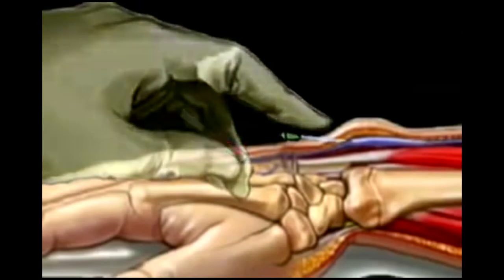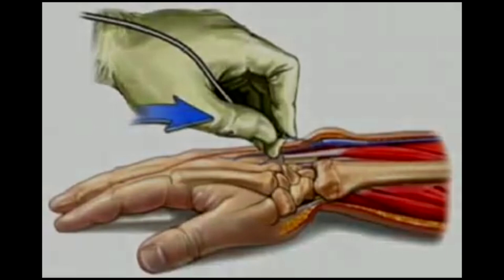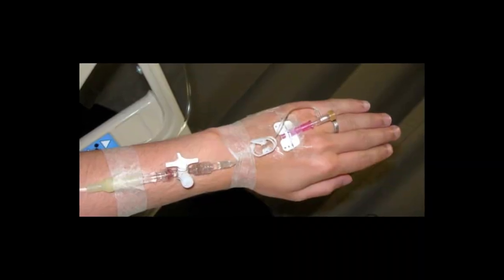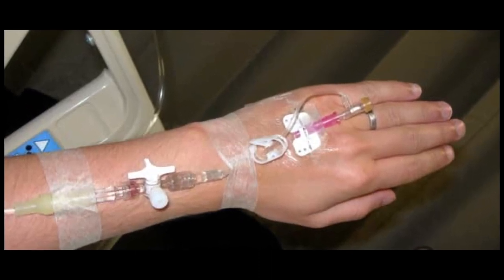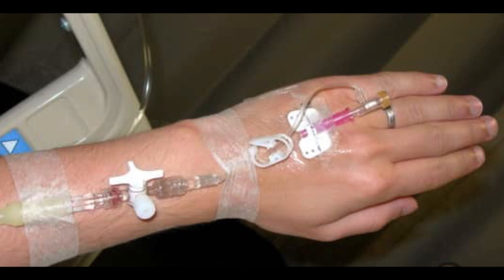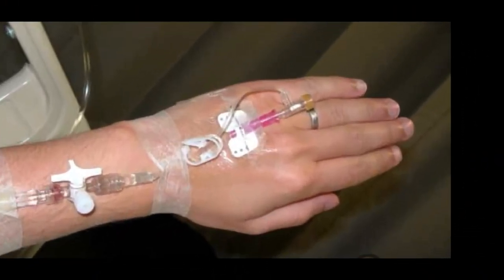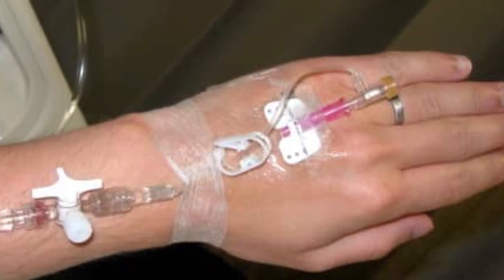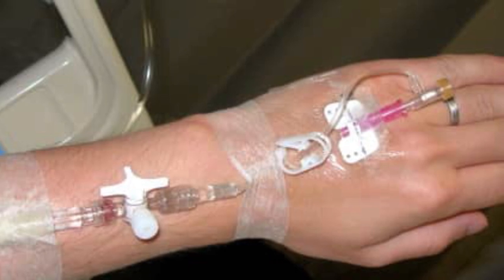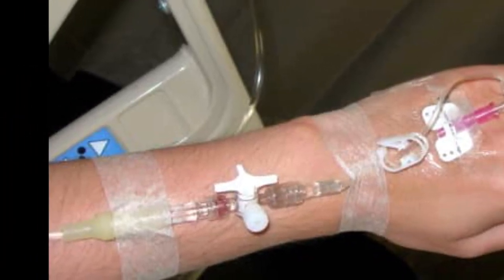The most common is the over-the-needle catheter. This is inserted into the vein via a needle that has a plastic catheter around it. The needle is withdrawn, leaving the plastic catheter in the vein. The hub of the catheter is attached to an IV tubing or a protective cap is applied. The second type of peripheral IV catheter is a steel needle variation, often called a butterfly, due to the wing-like plastic tube at the base of the needle. These are always small gauges and used for infants, blood draws, and for smaller veins.